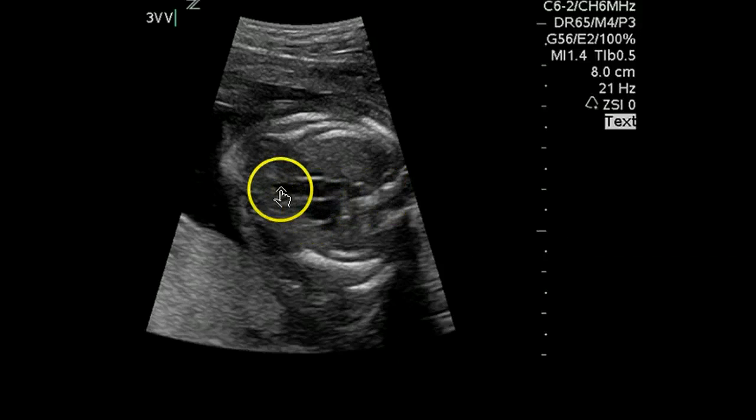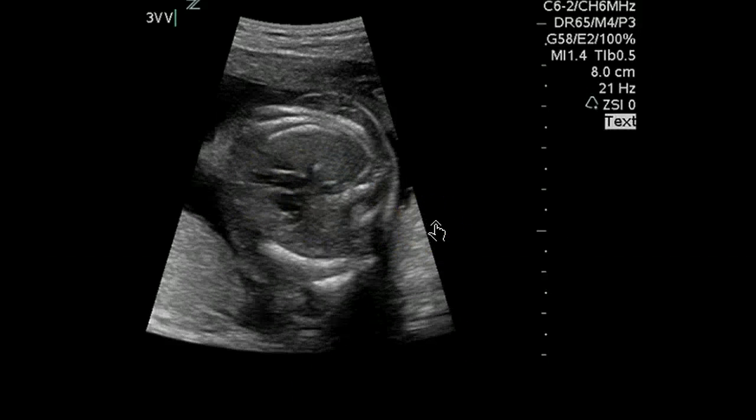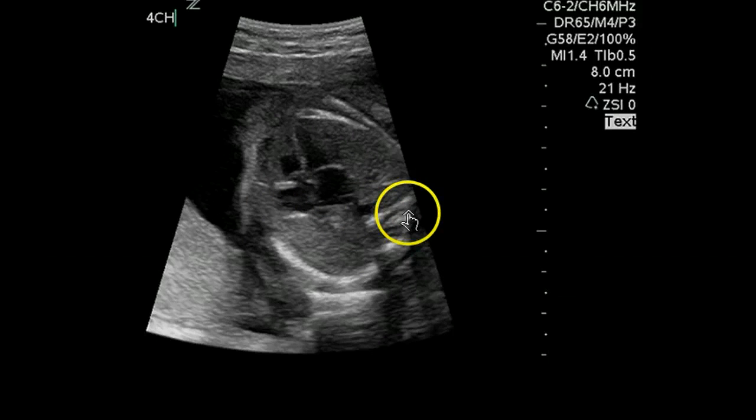And we see, if you want to call it the line dot dot or the dot dot dash view, but this is the ductus arch, the aorta, and the SVC. Now we'd like these two to be about the same size, or this one to be a little bigger. You could argue this is slightly bigger than this one, but I'd probably pass it. Here they look about the same size. Notice as you get a little higher, the aorta starts crossing over here. It can get confusing a little bit if you're not used to looking at that view. It's going to cross over and attach to the descending aorta right there.